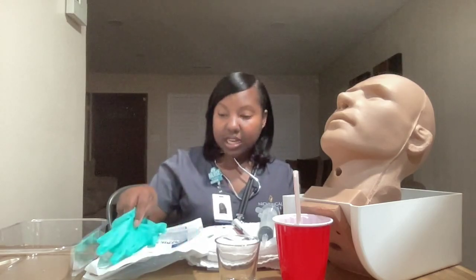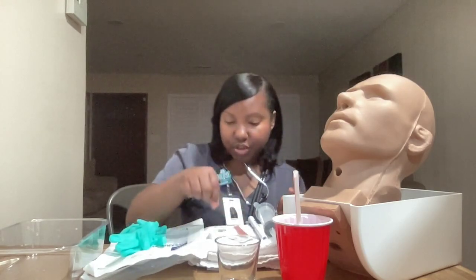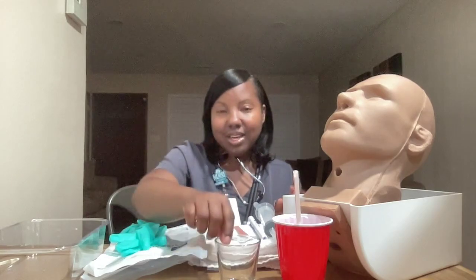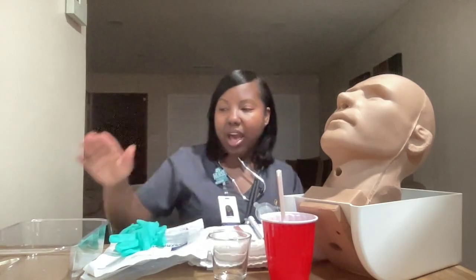The supplies I'll be using: I have clean gloves, an 18 French gastric tube, a 60 milliliter syringe, a towel, a pen light, lubricating jelly, tape, a pH test strip, a safety pin, a specimen cup, a cup of water with a straw, a basin with warm water, my stethoscope, and my patient.